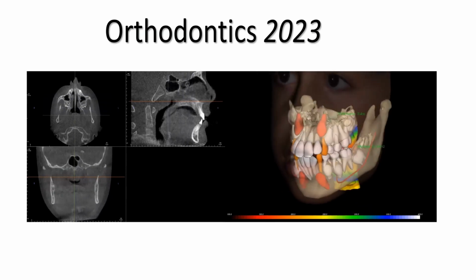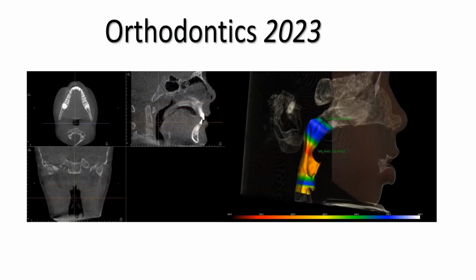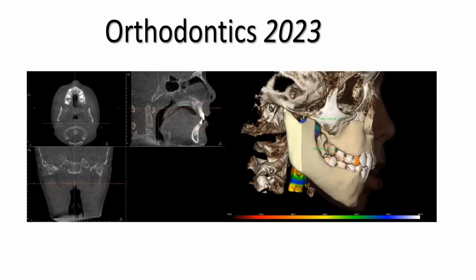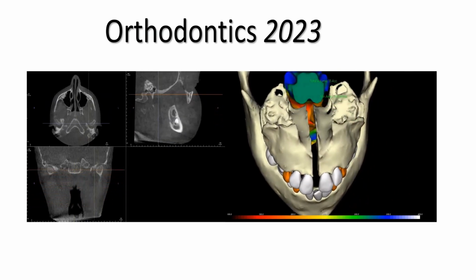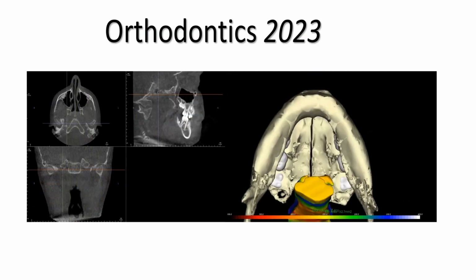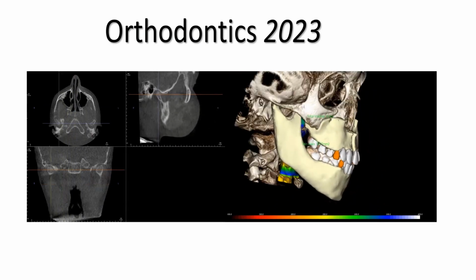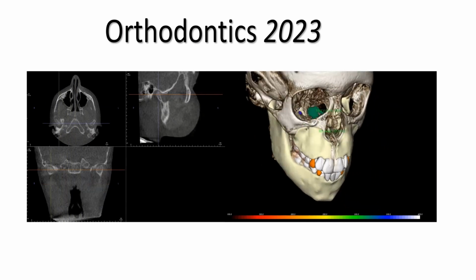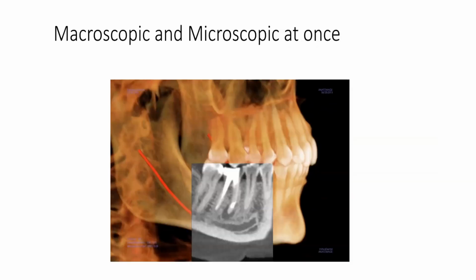This is Orthodontics 2023. And needless to say, this volume, we can dissect it into the 3 planes of space. So great for airway analysis, sinuses, jaw asymmetries, adenoid tissue, a lot more than just dental stuff, right? Soft tissue, airways, okay? Now we can start to build all these pieces of information in our mind to come up with better solutions for patients, okay?